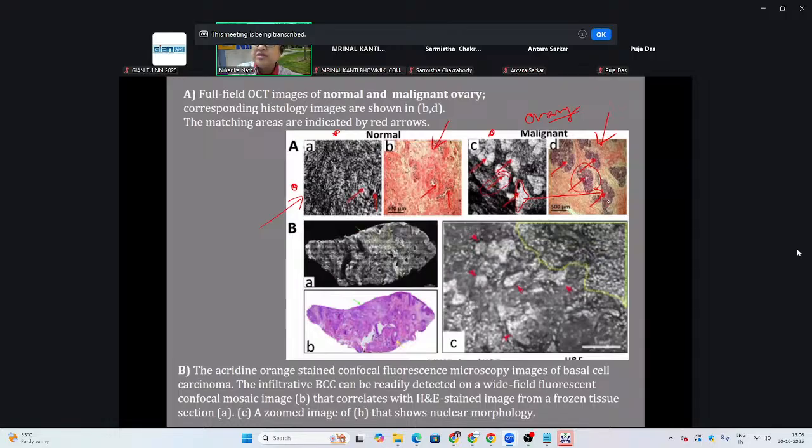These are locations of cell growth, locations of these tumor cells that are being surrounded by stuff. Here also look at the normal cells. In the normal cells it's really hard to tell what's going on, and so they have put in arrows for the normal cells to be able to identify the locations.